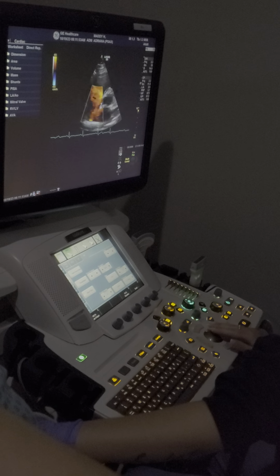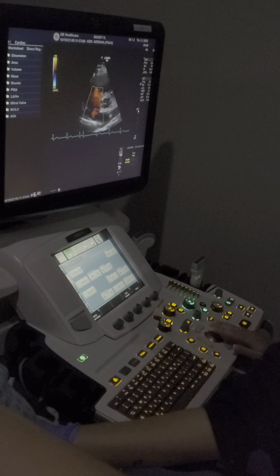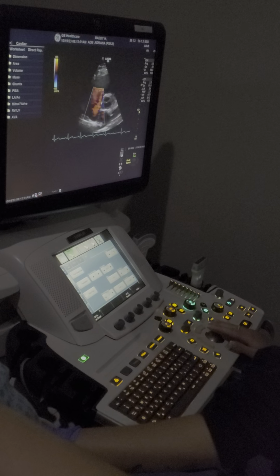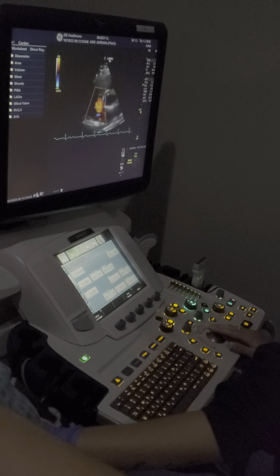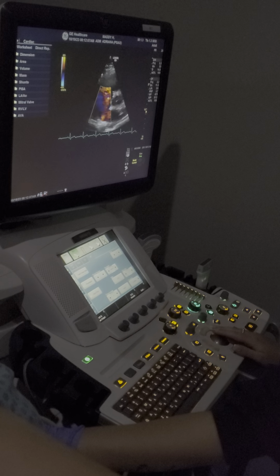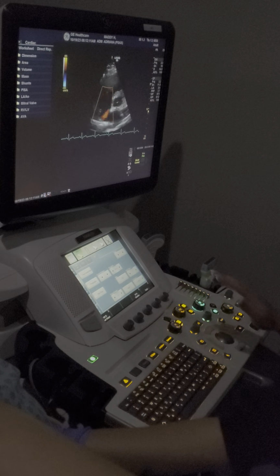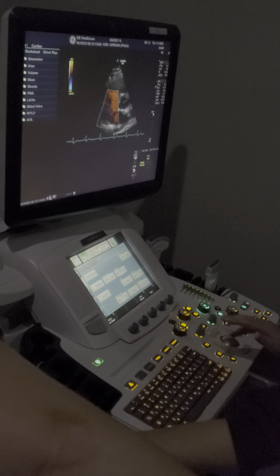On our lab, it says mitral valve. I'm gonna get there. Oh, okay. Yeah. So I didn't know if it was supposed to be tricuspid. Nope. Okay. So this one's tricuspid. It should say tricuspid in the very first one. Under aortic, base level, aortic level. Third. It's right here. Oh, okay.